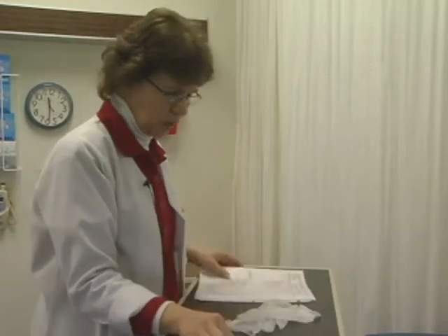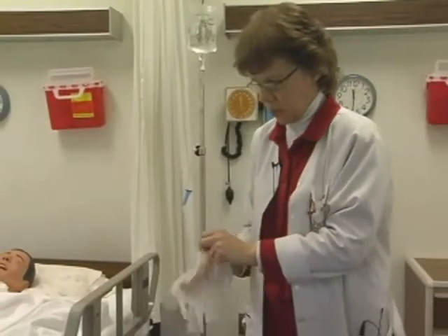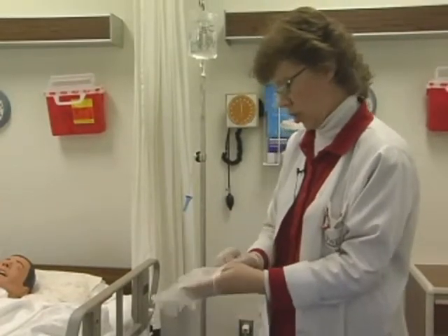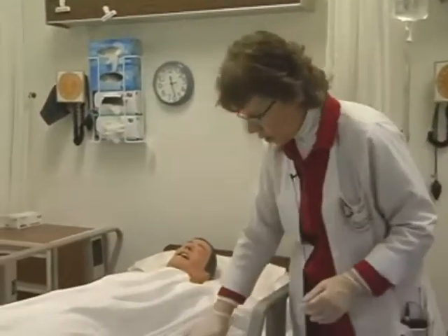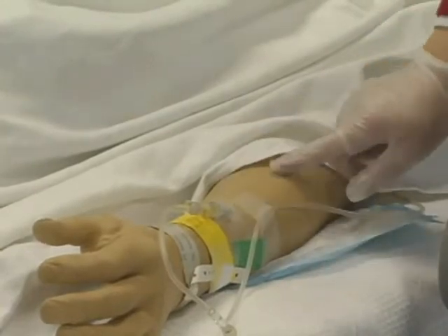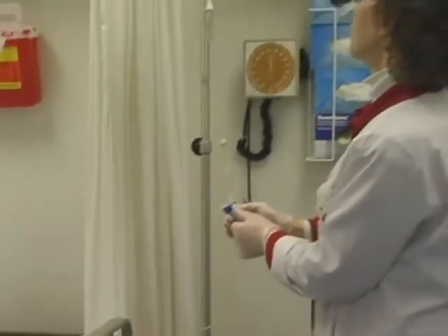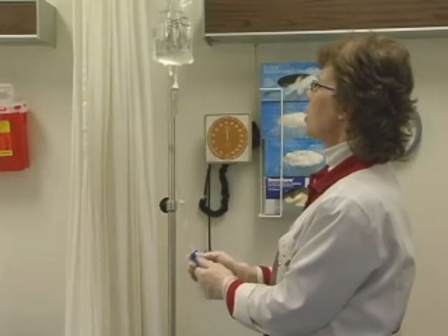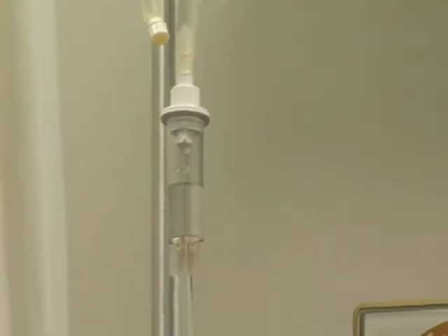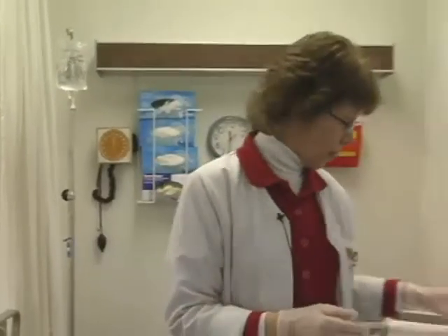And I'm going to put my gloves on. And I'm going to come over and take a look at the IV to make sure that it's functioning properly so he can get this medication. So I'm looking at the arm for any infiltration, any coolness or whiteness in the area, any phlebitis, redness or red streaks, and then I need to check to make sure that the IV is infusing. And it is infusing, so I want to readjust my rate to 125 mLs per hour, and that doesn't have to be exact. It just needs to be a pretty steady drip to make sure that the medication will flush in quickly. Okay.